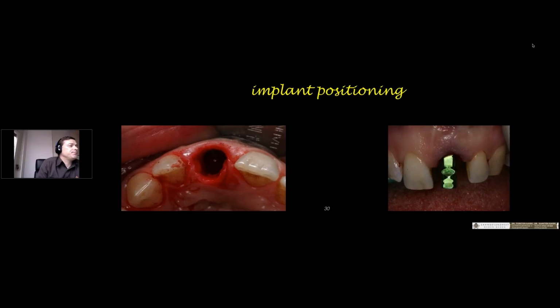So this is another case. You see, this is in another system, but I chose this because it's easier with some systems to see how deep you can put the implant. You see the mark on the left side of the implant, and this mark will be 3 millimeters. I measured before that 2 millimeters below the soft tissue begins the bone, and so it's very easy to handle how deep I have to screw in my implant.